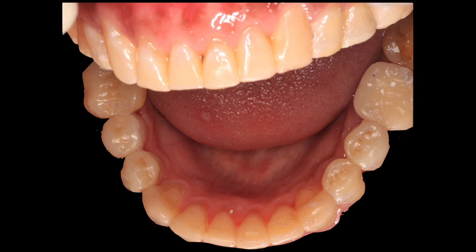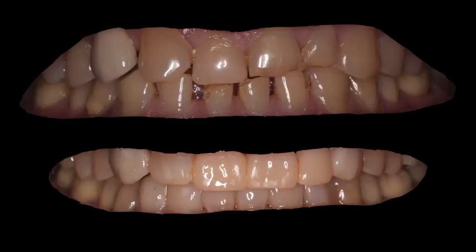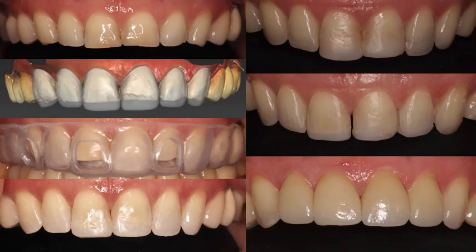These are completely non-prep. All the cases I've shown you so far, there's no preparation at all. Another similar case, a patient had this kind of bite. We just created that with composite, again injection molding, and even the shape of the lip changed. These are other techniques which I had done in the past, but in this case the patient did not like it. It had gone pretty well, but the patient was not living here and wanted something more definitive, and we had to go on the patient's demand. But ideally I would not go with that.